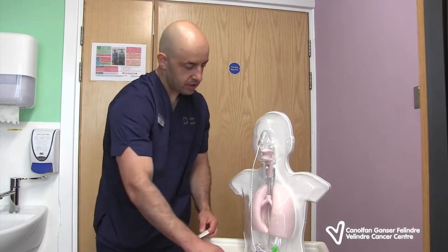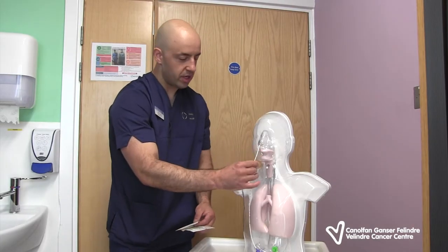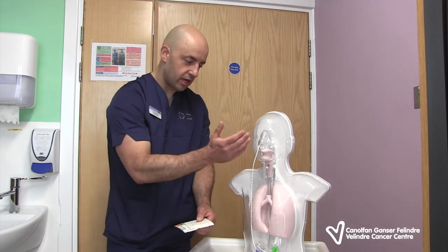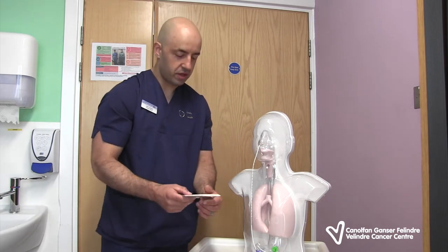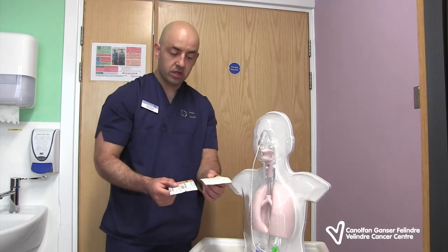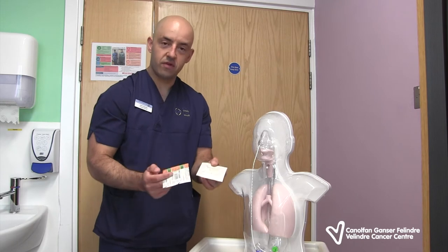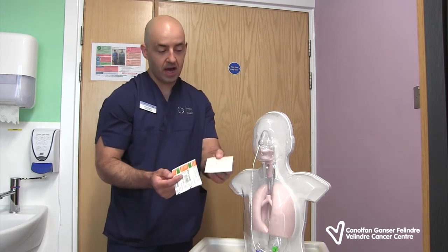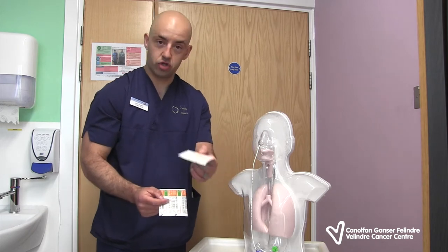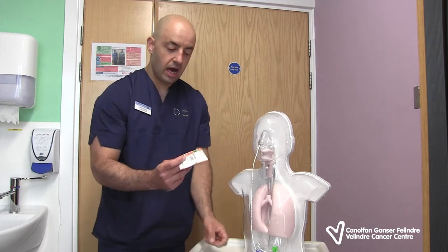So, when you have your NGT placed, or your nasogastric feeding tube, if you find that your dressing starts to unravel with water and moisture or just from use, what we can do from the patient support unit is give you the dressings to take home and replace your nasogastric tube dressing. So what you'd have is the Duoderm spot and the Opsite Flexigrid.